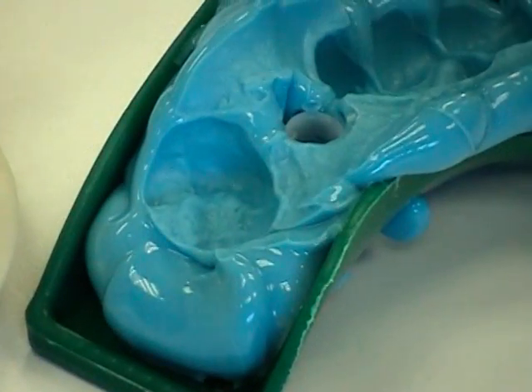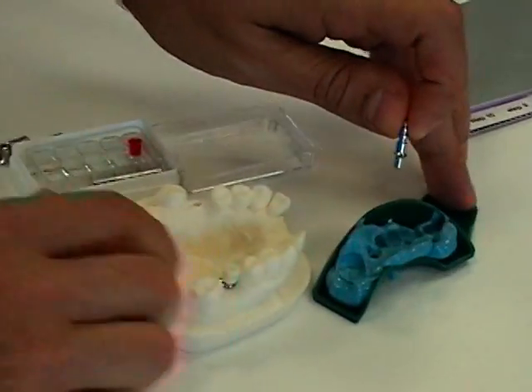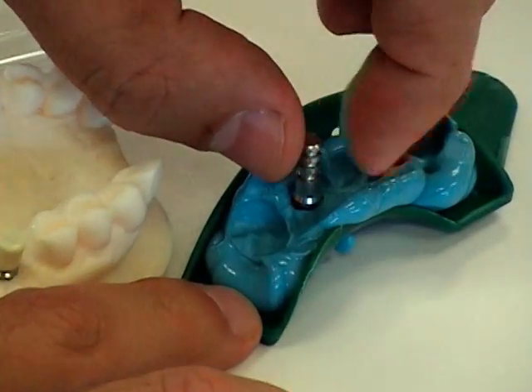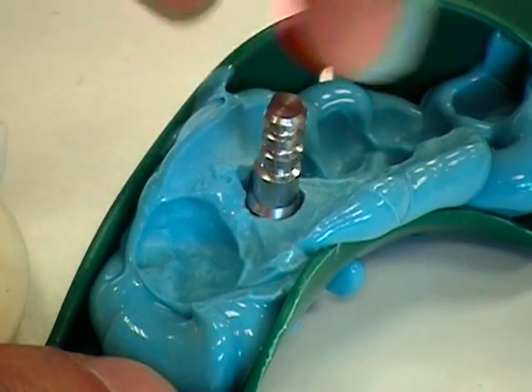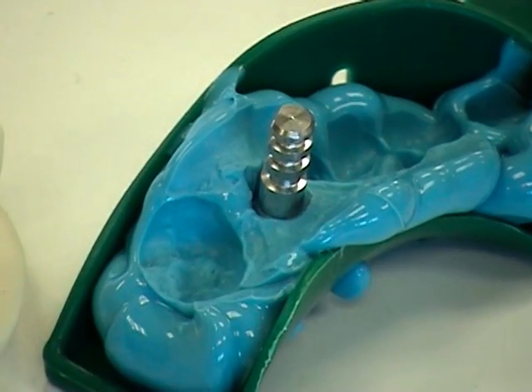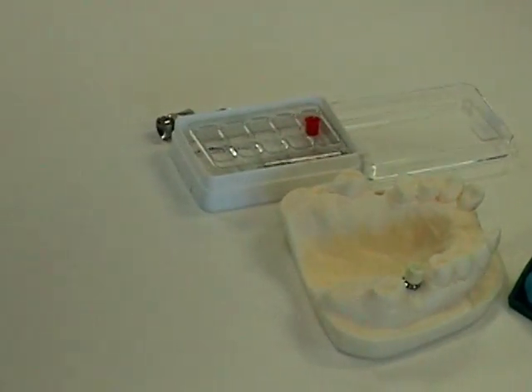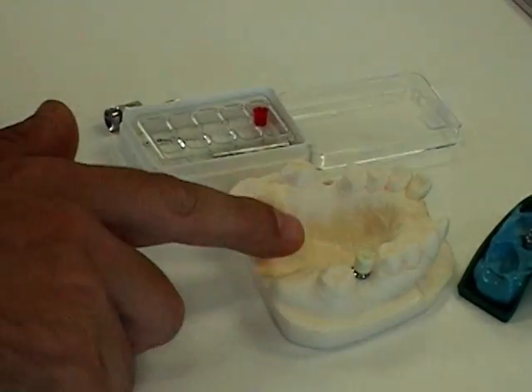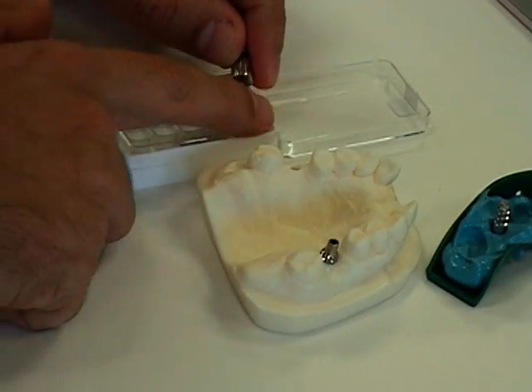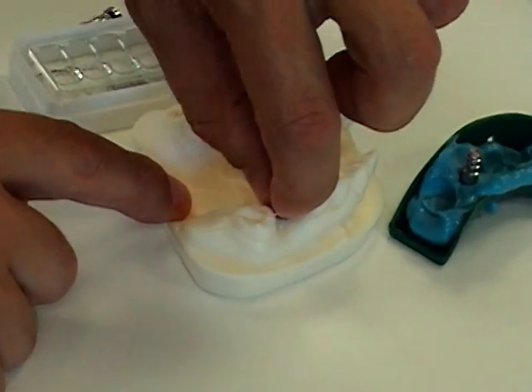Meanwhile, we'll be sending the impression material, the analog, and the burnout plastic — the remaining pieces from the Complete Prosthetic Set — to the lab. The analog is inserted into the plastic piece, aligning the flat side so that it will fit into place. From here, the lab will create a stone model where the abutment level analog protrudes in the same manner that the abutment is in the patient's mouth. The lab will connect the burnout plastic to the top of the abutment analog, where they can modify it, as we're demonstrating here.